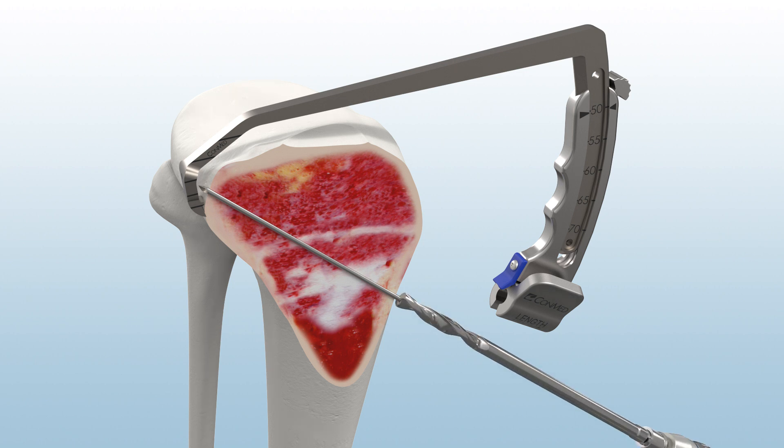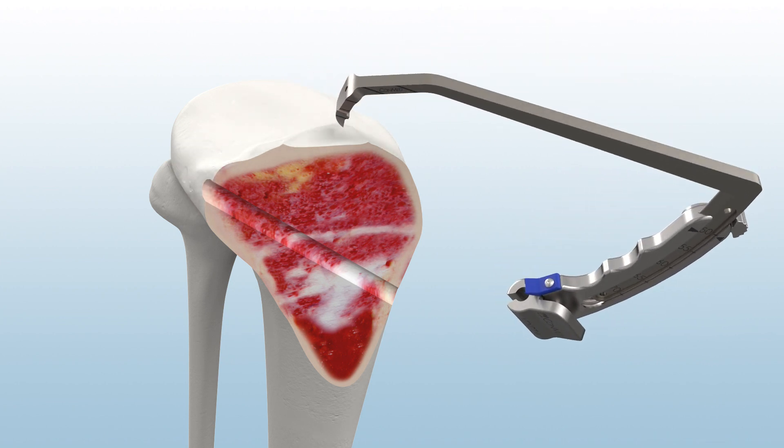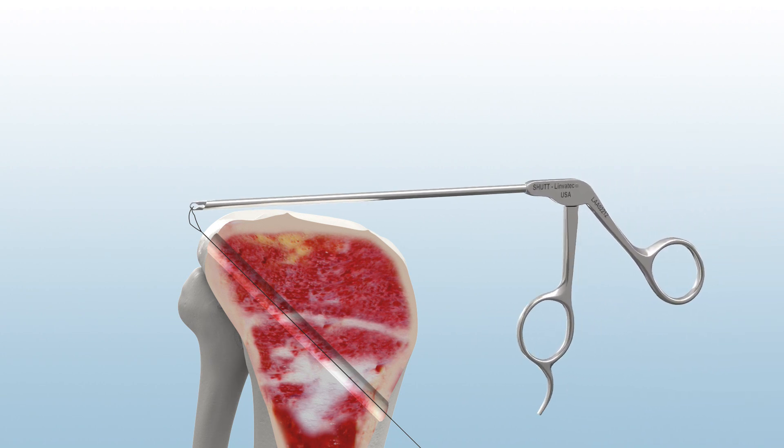Advance a constant diameter reamer under direct visualization until contact is made at the pin capture point. Then, remove the guide. Use the Infinity Suture Shuttle to prepare a passing suture for graft passing through the anterolateral portal.